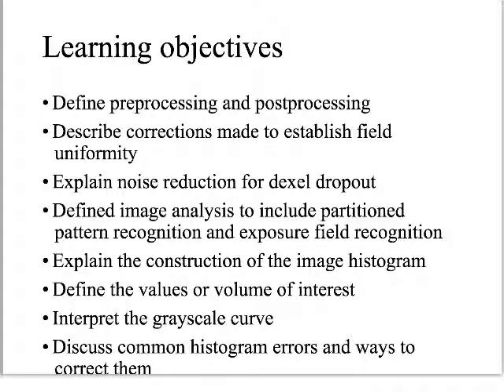So the major metaphor of the day is that we want pretty pictures, right? And so we want to be able to take pretty pictures. That's the reason why we put on makeup, is to look a little bit more pretty. That's what we're doing when we apply these pre-processing algorithms to our x-ray pictures, is we're making them more pretty, easier to look at. Post-processing we will also define, and those are largely the things that we have some control over. So pre-processing is stuff that the computer does, post-processing stuff that we do.